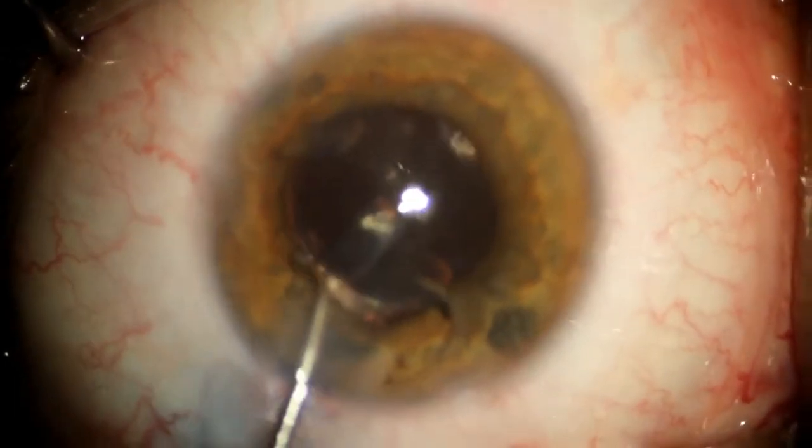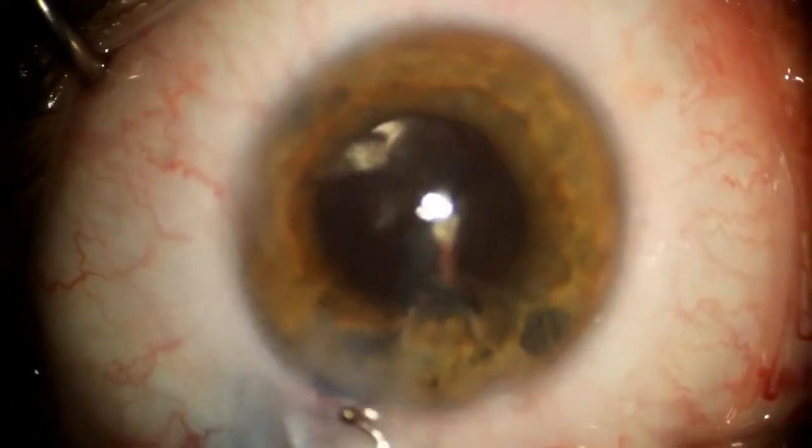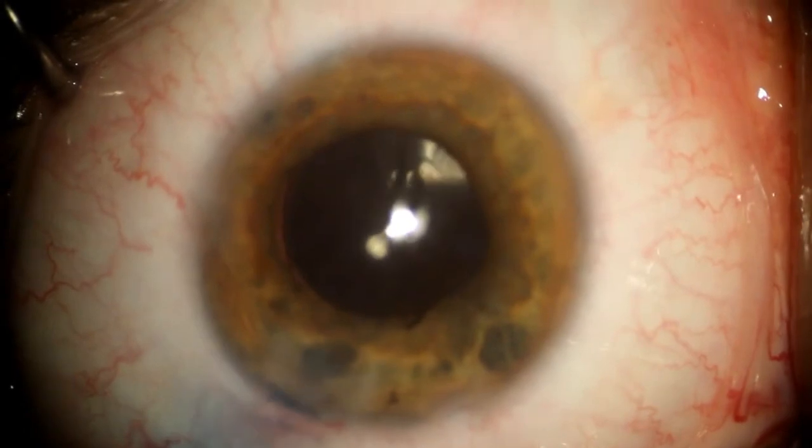So the other eyelets — positioning eyelets — and just remove it very gently from the eye just as this. As you can see, it comes out just like that.